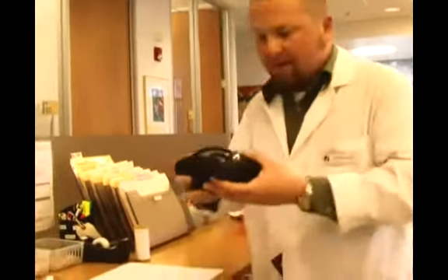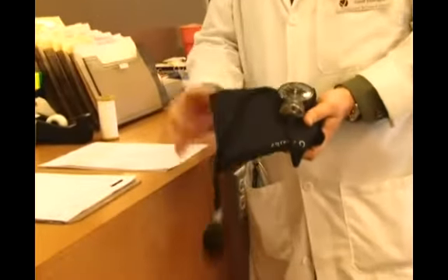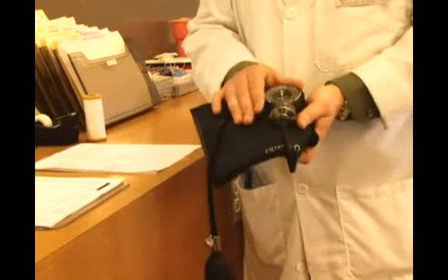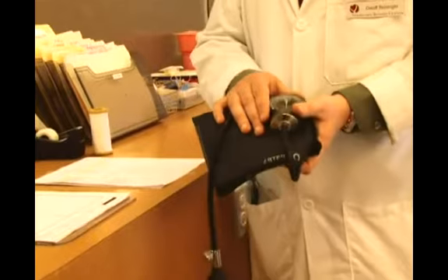When you're actually donating, there's two things that are going to happen. We're going to put this blood pressure cuff on your arm, and it's going to keep pressure on your vein to keep it dilated to make sure that we can still get a blood flow.